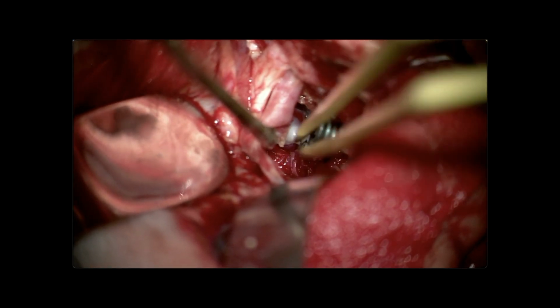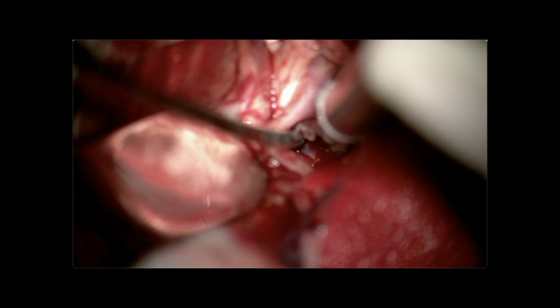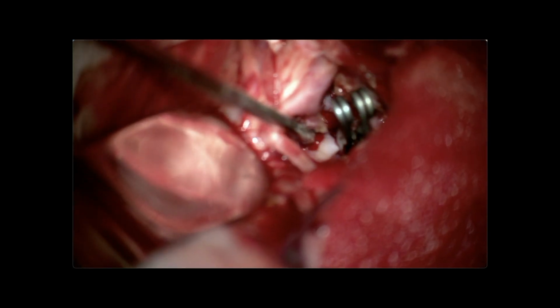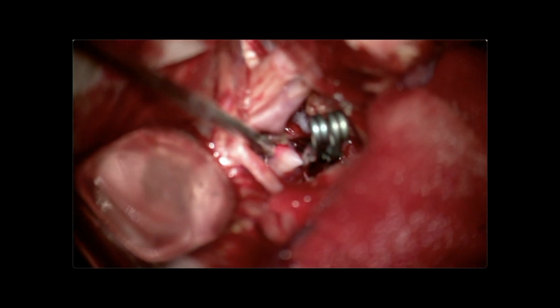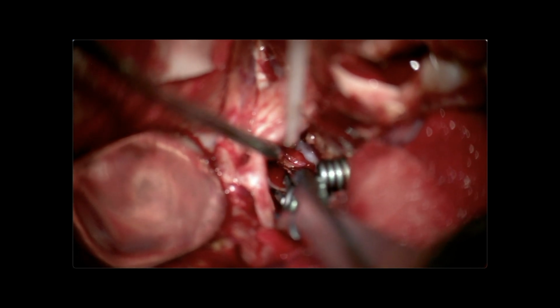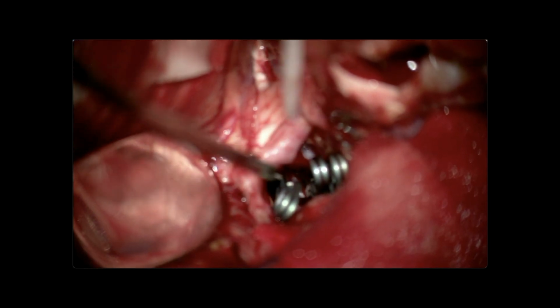Here we see that the aneurysm is still alive, which required additional clips to be applied. Again, during visual inspection, with an assessment of the course of the perforating arteries, an additional direct clip is applied to the aneurysm sac. A reinspection is carried out, excluding stenosis or damage of the perforating arteries.